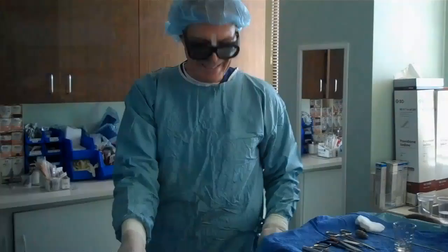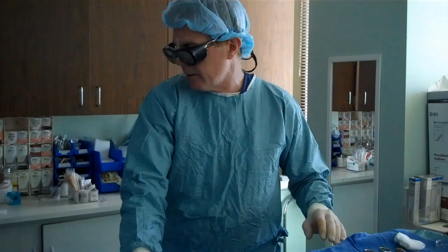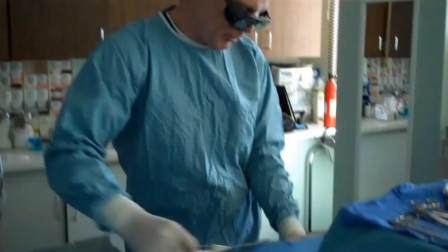We're going to do skin tightening now. The laser has been reset and readjusted, and I'm going to do the lasering right underneath the surface of the skin to promote more collagen and help the skin to shrink up. It's basically the same technique of going in and out like this. This is a little trickier because I'm actually heating up the skin and I don't want to get it too hot or cause a burn.